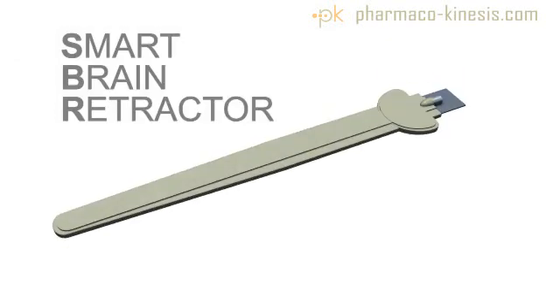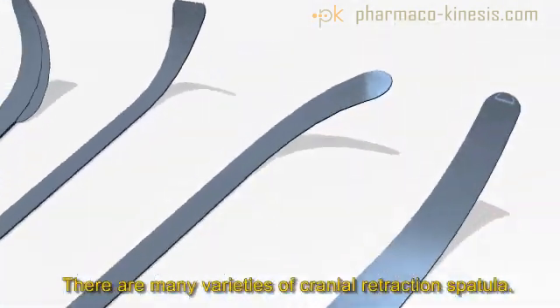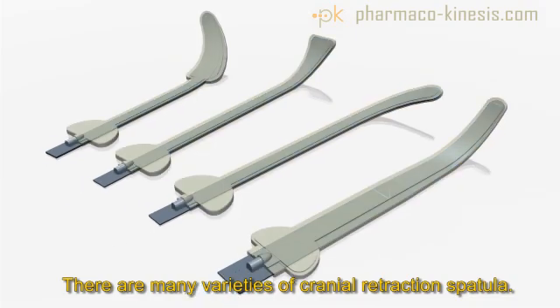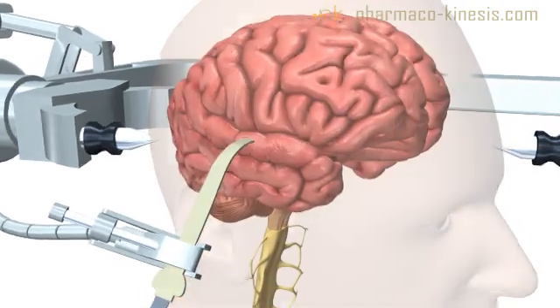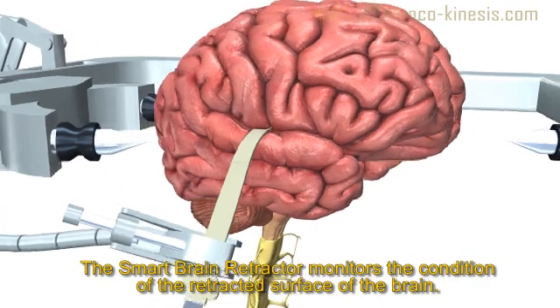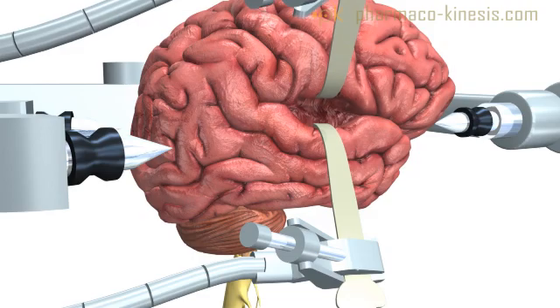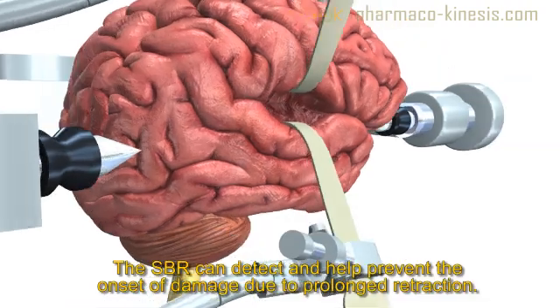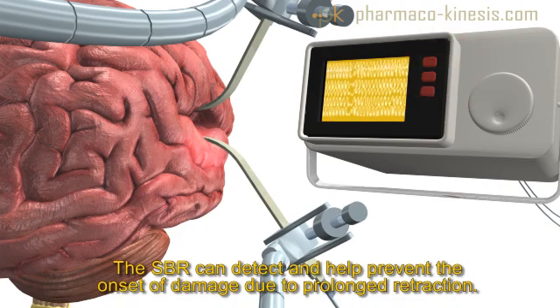The Smart Brain Retractor, or SBR, is a device which augments the standard types of surgical retractors used during many intracranial surgeries. Its purpose is to assist neurosurgeons in the early detection and prevention of retraction-related trauma during routine neurological procedures by accurately controlling and minimizing the disturbance of brain tissue being operated upon. The Smart Brain Retractor allows physicians to directly monitor brain activity at the site of retraction and provides early warning as to the viability of the underlying tissue to prevent the occurrence of hypoxic ischemia.